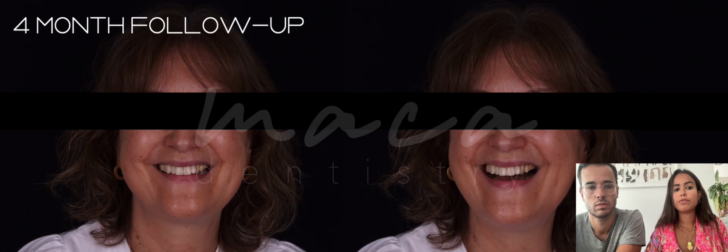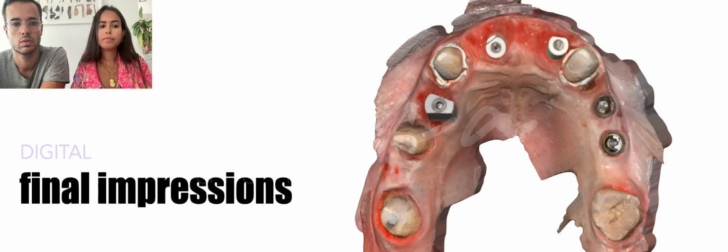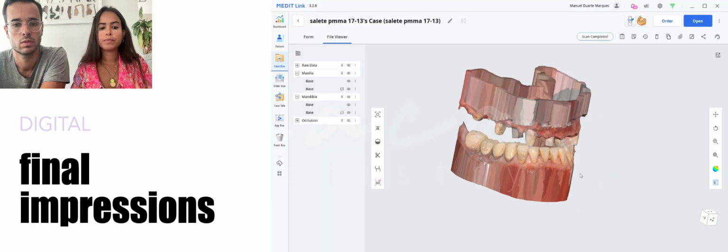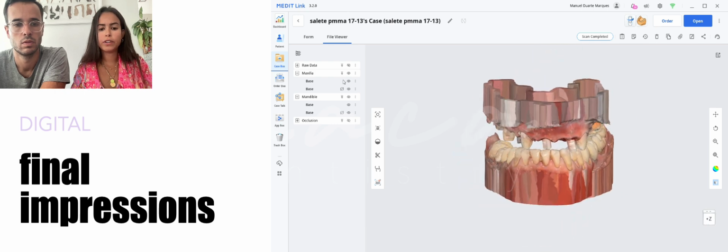These are the extraoral photographs 4 months after the surgery, and at this point we were ready to proceed with the final impressions. This was the appointment of the final impressions. You can see the scan bodies in place. And here a screenshot of the final impressions. Also a video of the final digital impression.